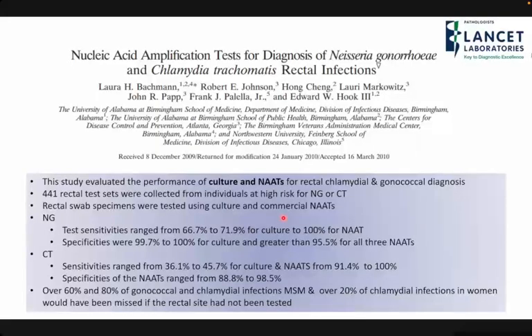culture, because in these panels we don't have Chlamydia, we don't have Candida, and in case you want to see whether there's Candida, and we can't do sensitivities with molecular panels. And unfortunately, with the rising ceftriaxone resistance in gonorrhea, we do need to do surveillance and see if we are seeing that as well.